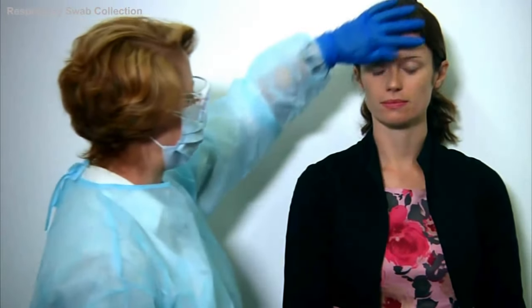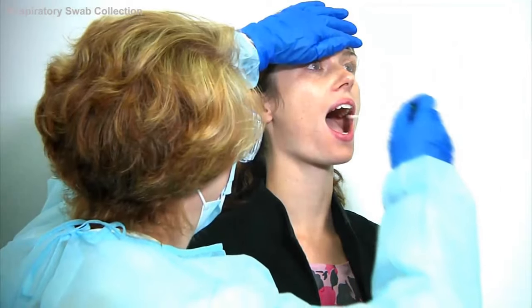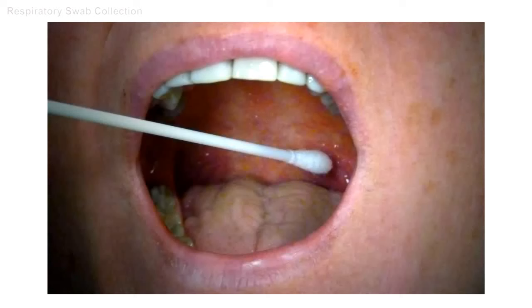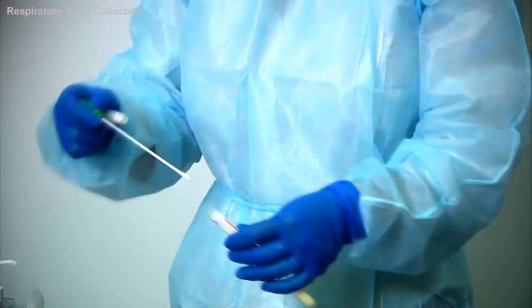Place one hand on the forehead and ask the patient to open their mouth widely for collection of the throat swab, inserting the swab while avoiding any saliva. The uvula hangs from the centre of the throat with the faucal pillars on either side. The swab needs to be placed just behind the faucal pillars. Place sideways pressure on the swab to collect the epithelial cells from the pharynx, then place the swab back into the swab tube.